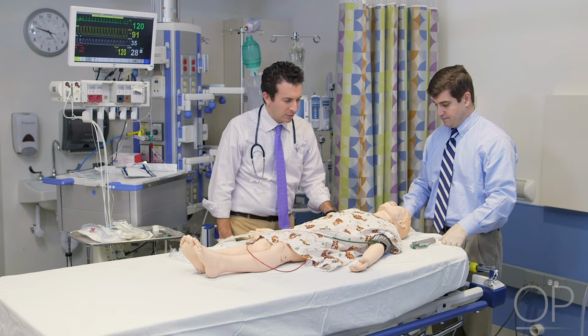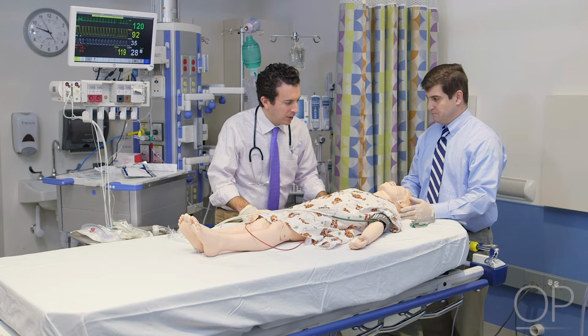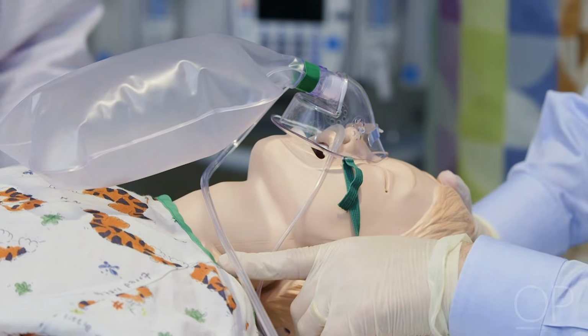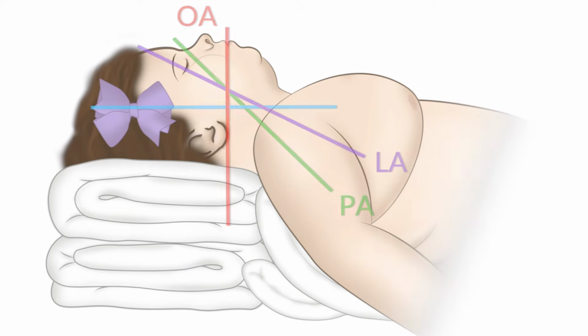The patient should be appropriately positioned utilizing proper bed height, head position, and a shoulder or head roll as indicated by patient age. For an obese patient, one or more pillows may be required to improve the laryngeal view. This positioning is called ramping.